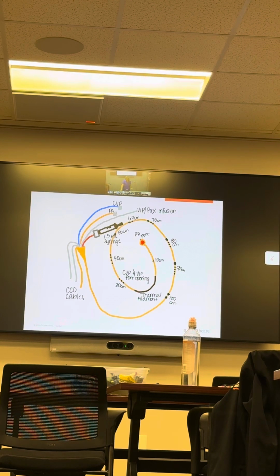Number 1 is your right atrial port or your CVP port. It's blue on here because it's blue on the monitor, Fisher-Price. I am fine with a 3-way stopcock here that has an IV access port because in the event of an emergency, I don't care what your CVP is. Let's just push the epi. Let's just slam the blood. I can rely on this going to the right spot. Okay? But this is not for your electrolyte replacement. This is not for your insulin drip. None of that business. This is an emergency port if you need one.